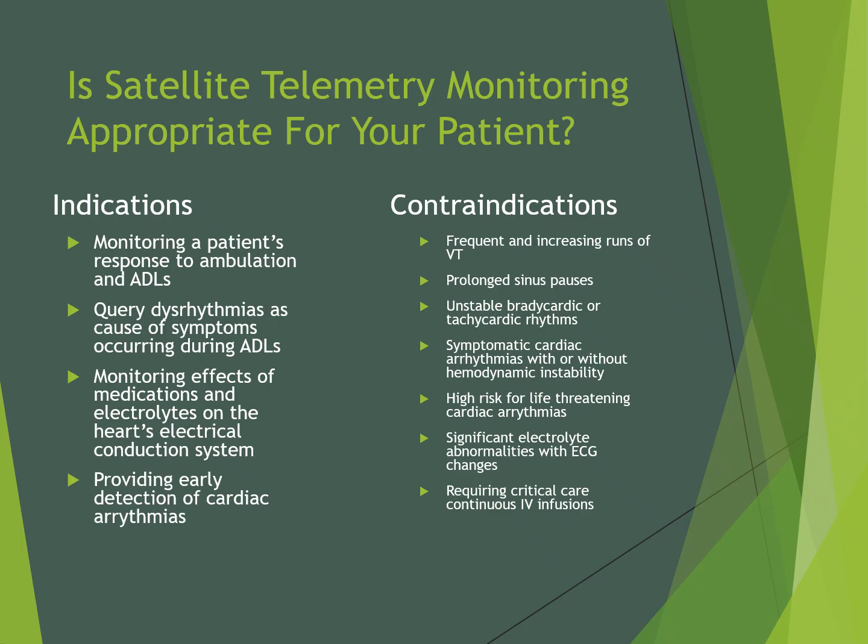And for clarification, cardiac monitoring is not synonymous with satellite telemetry monitoring. Cardiac monitoring would include being on a bedside monitor with a nurse trained in cardiac rhythm analysis as their primary nurse.